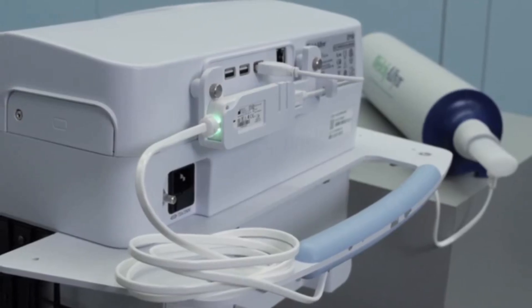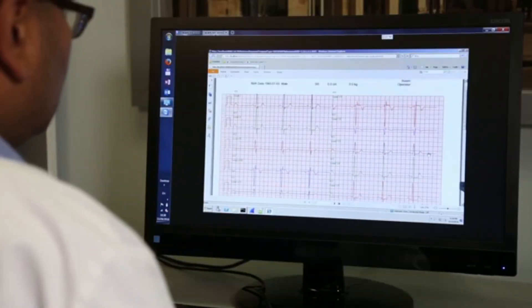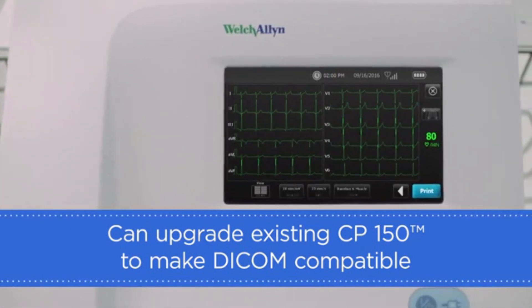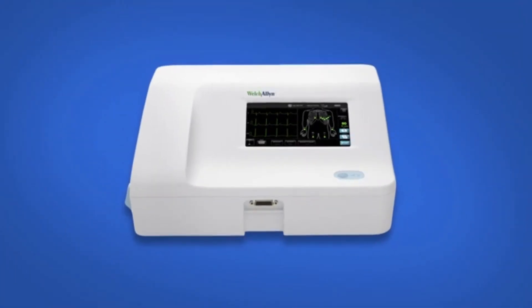With optional spirometry, you will receive a spirometry kit which mounts on the back of the device. With the optional DICOM feature, the device comes with out-of-the-box connectivity to a DICOM server without the need for middleware. For current device owners, you have the ability to upgrade your existing CP150 to make it DICOM compatible.